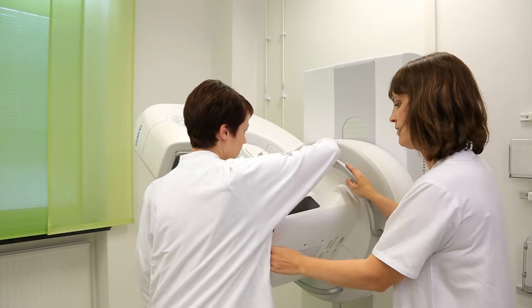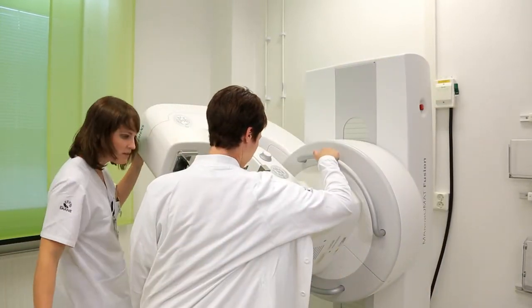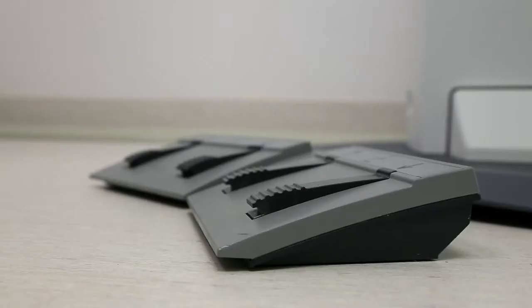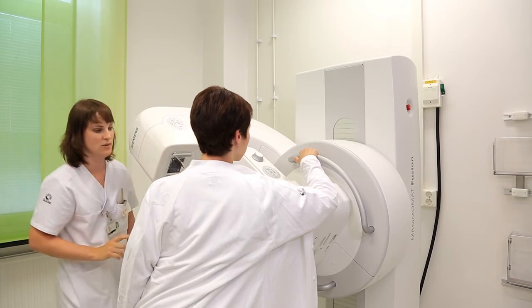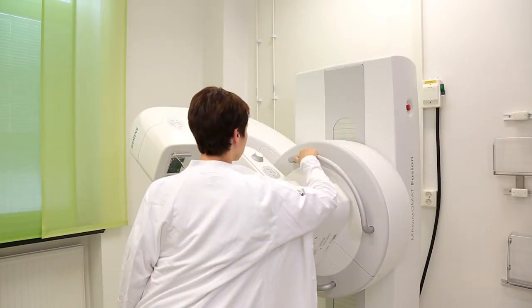The system is also very quiet and I like the design, but in the end the examination is fast and more comfortable for the patient. I can recommend MammaMath Fusion. It is fast and easy to use with excellent image quality. Positioning is easy and comfortable for the patient and we have had a long very positive experience with Siemens.